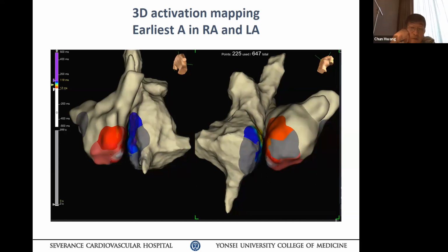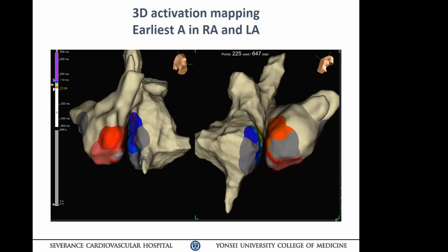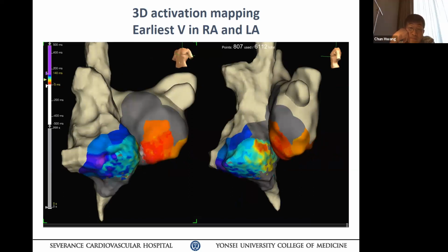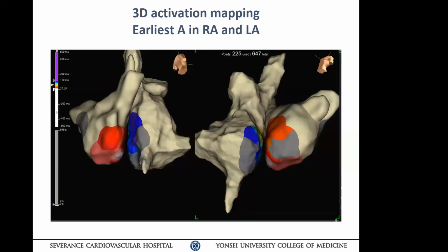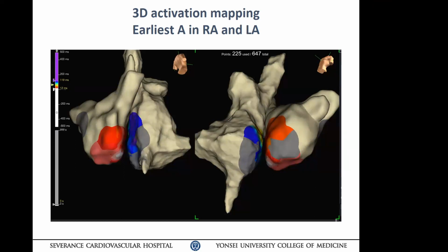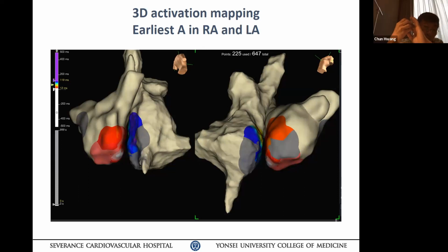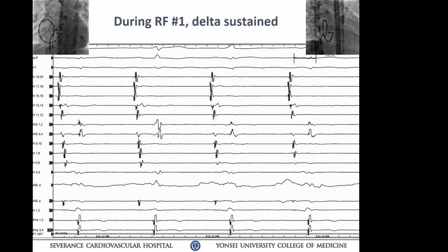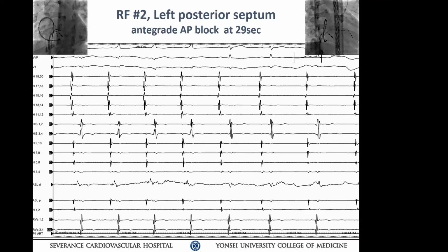HDLA를 다 했는데요. 이게 사이너스 때 antegrade 매핑을 했을 때는 RB 액티베이션이 제일 빨랐고요. 그다음에 반대로 V 페이싱에서 했을 때는 left posteroseptal 쪽이 제일 빠르고요. 봐서는 아마 바이패스 트랙 A 인서션은 LA posteroseptal 쪽에 있으면서 크로스에서 RA posteroseptal 쪽으로 나가는 것 같았고요. 처음에 LA posteroseptal에서 ablation하면서 한 10초 지나면서 delta가 떨어져 나갔는데 delta는 조금 더 다시 붙었고, 다시 RA를 보면서 right posteroseptal에서 ablation하면서 delta는 그때부터 완전히 없어졌는데, 그때부터 이게 CBT로 바뀌면서 incessant pattern이 계속 나오더라고요.